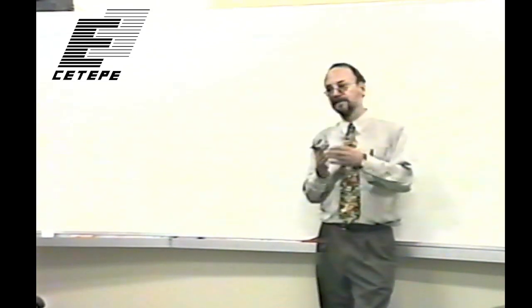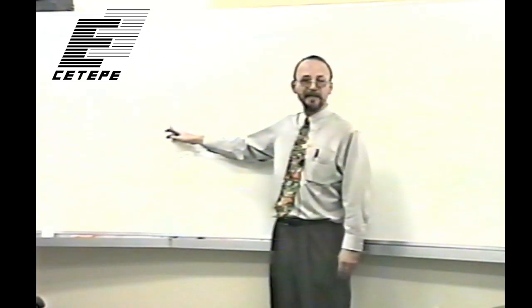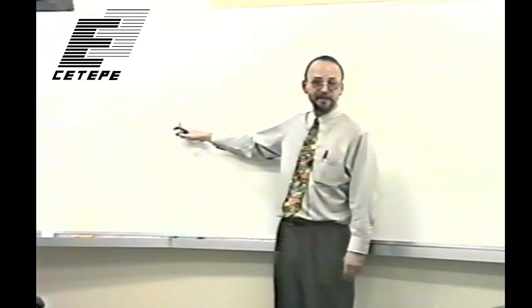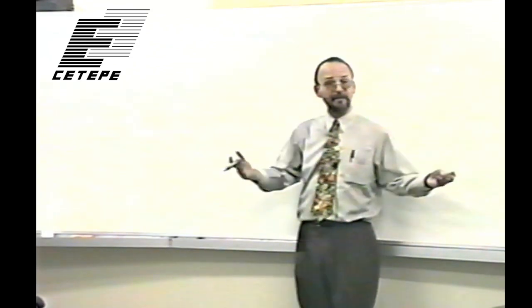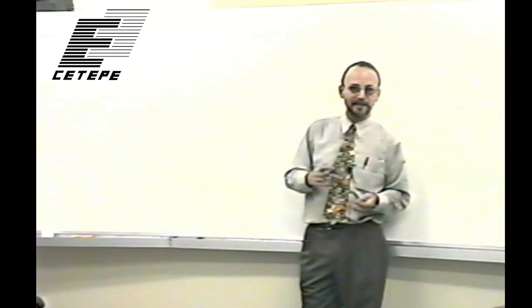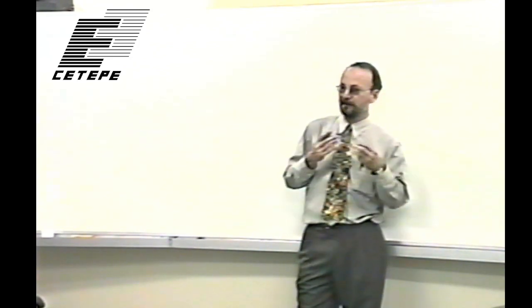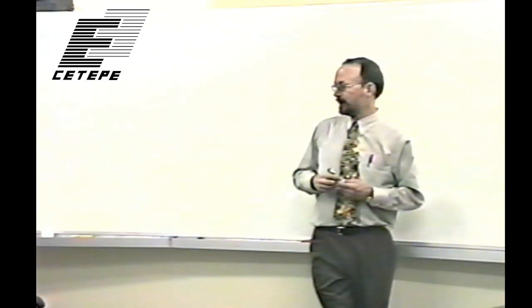So then if we were able to subtract the low energy image below the K edge from the high energy image where the iodine absorbs strongly, we'd get rid of everything. Everything in the image would almost go away except for the iodine. Okay, so we would just have a very dramatically enhanced contrast of the blood vessels.